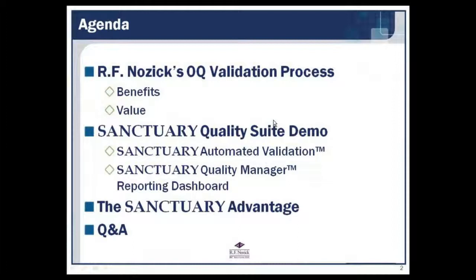We're going to go over the Sanctuary Quality Suite demonstration. The Sanctuary Quality Suite is an online application where you can view all of the validation results, all of the validation scripts, as well as a hazard analysis. It's a reporting dashboard that the whole hospital can look at and see what happened in validation in the blood bank. The Sanctuary Advantage is cost. The Sanctuary Advantage is time. Next slide, please.